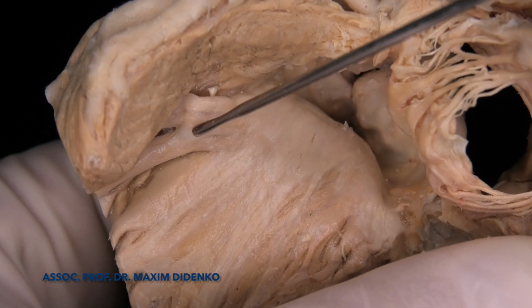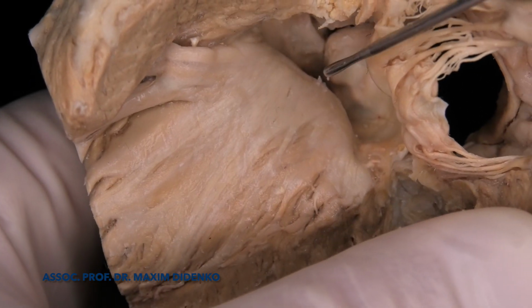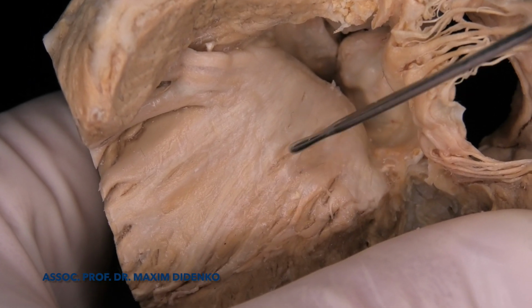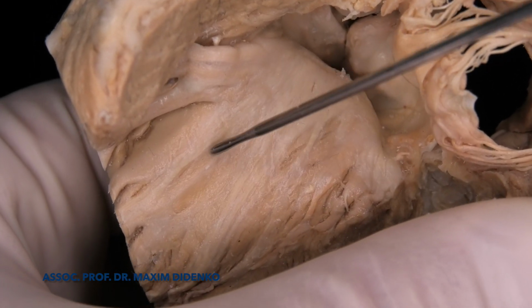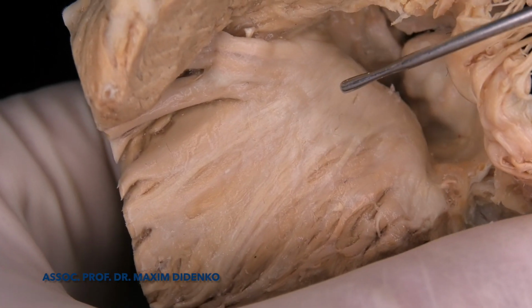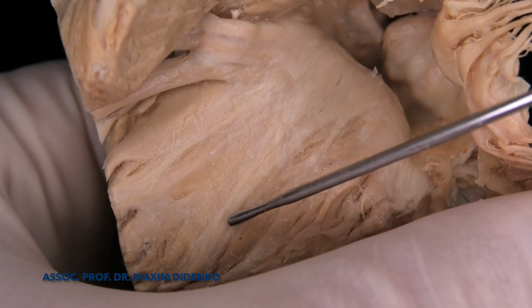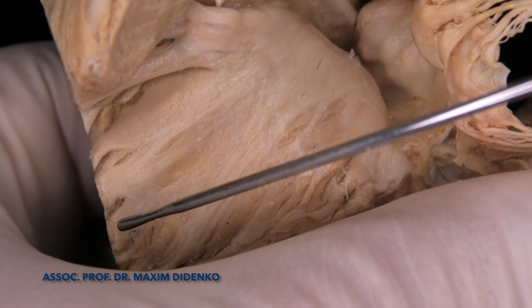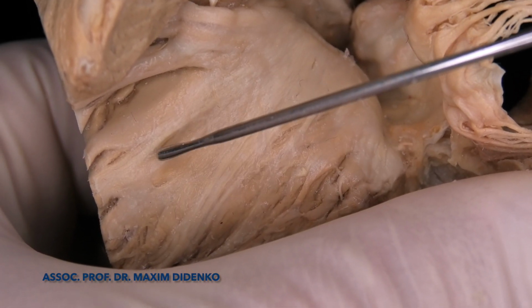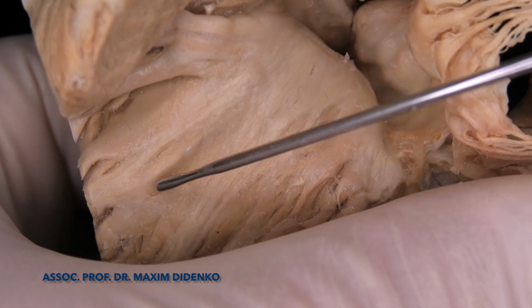This is the anterior or superior fascicle, this is the inferior or posterior fascicle, and this is the septal. We can see nicely that these fibers can divide and then be connected again. So in between these fibers we can see areas with just myocardium, without conduction system.